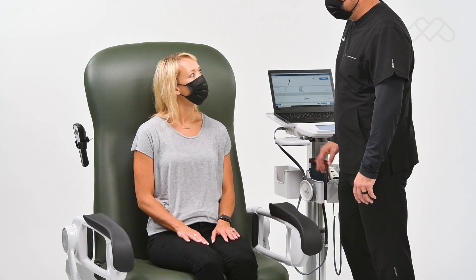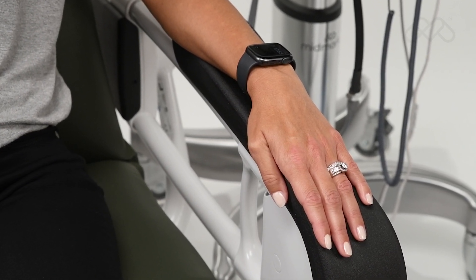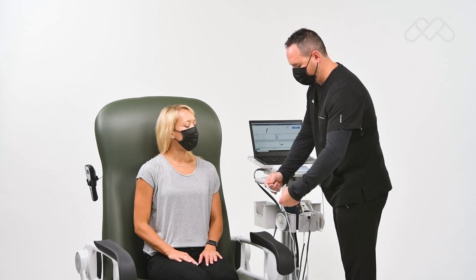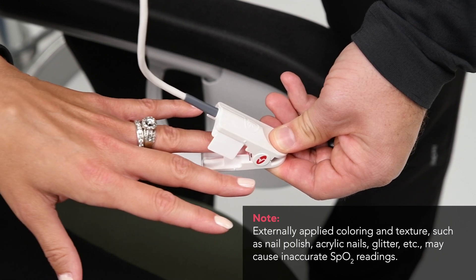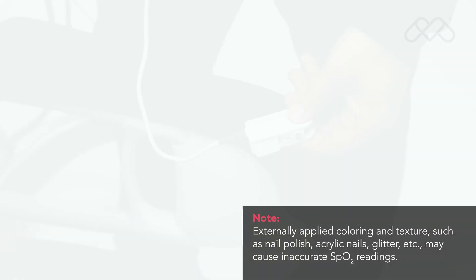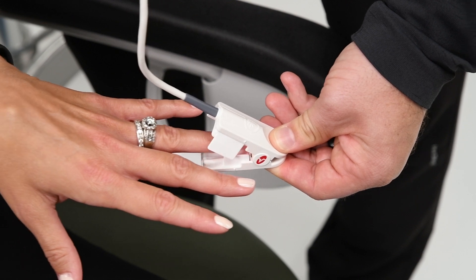To initiate a reading, choose a site that is well perfused and least restricts a conscious patient's movement. The ring finger of the non-dominant hand is preferred; alternatively, the other digits on the non-dominant hand may be used. To attach the sensor, first open the sensor by pressing on the hinge tabs, then place the selected digit over the sensor window. The fleshiest part of the digit should be covering the detector window in the lower half of the sensor.